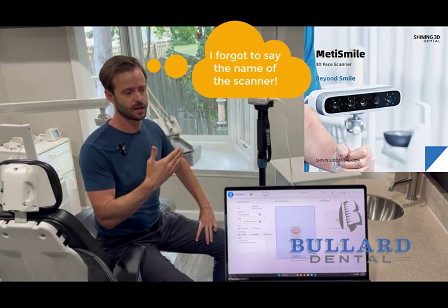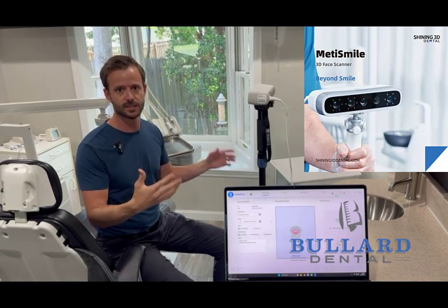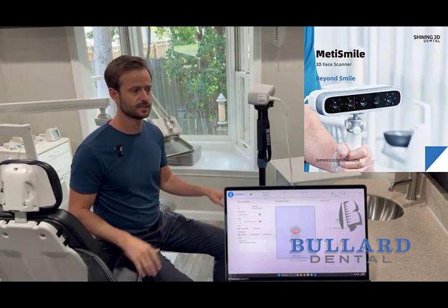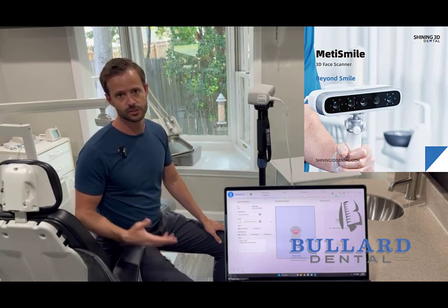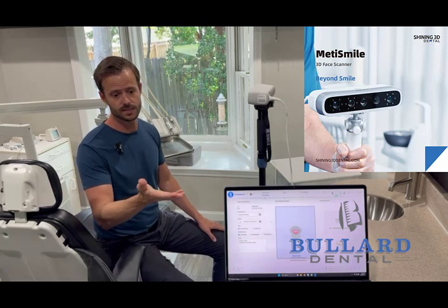In ExoCAD you can see the face scan where we marry it up to our intraoral scans. Our intraoral scans were done with the Prime Scan, but it would be the same with the Trios or any other major scanner. Austin is going to set up the software and I'm going to get in position.